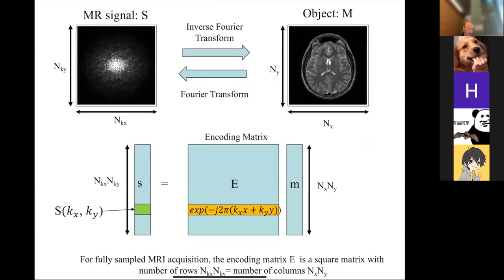Okay. So last time we talked about this picture that we've had from the very beginning: we want a certain object, and in MR, we're acquiring the data in Fourier space. And when we think about it, it's most intuitive to think about a 2D object because we see things in 2D, and then we have a 2D Fourier transform, right?